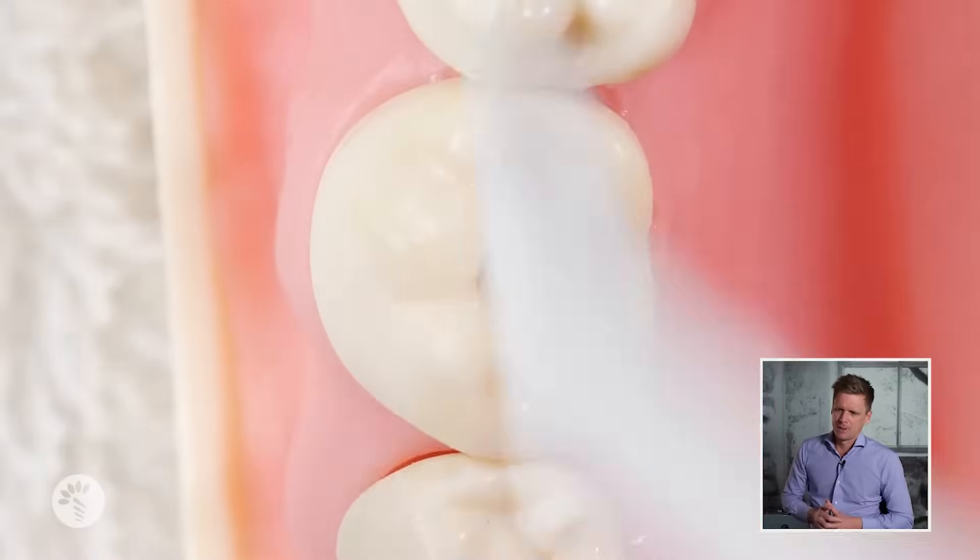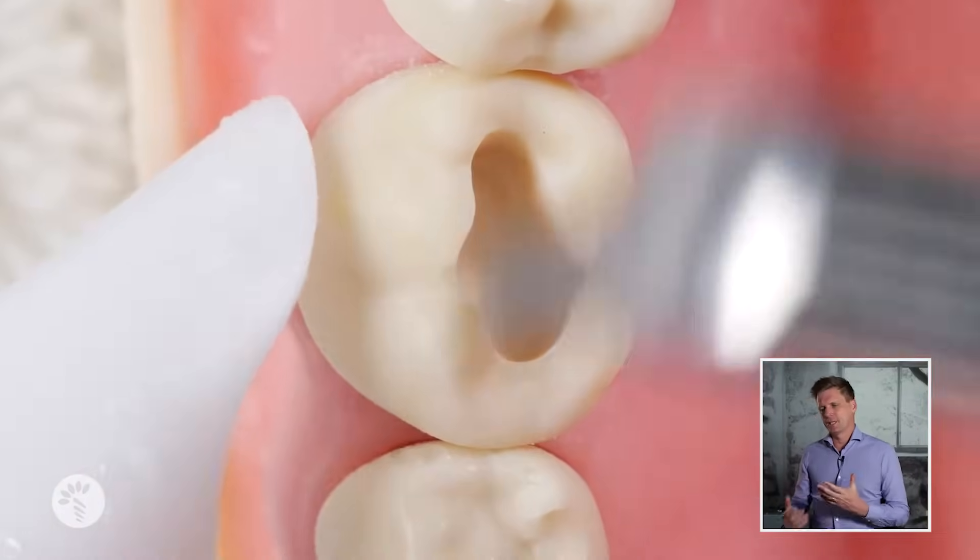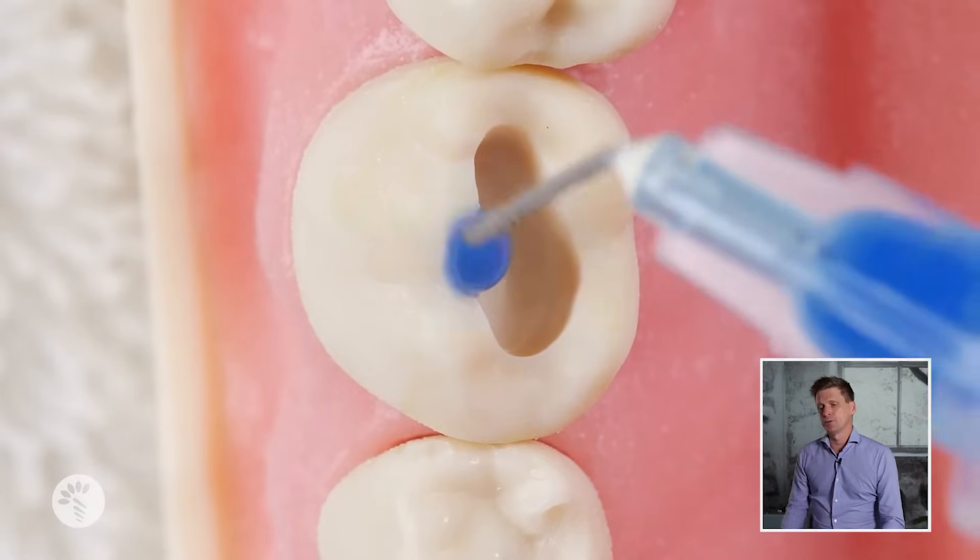The Class 1 composite is often seen as a simple thing but it's actually quite technical. In general you want to air abrade, because one of the biggest causes of staining around composite resin is plaque or debris, particularly in the fissures on the occlusal surface — and you can't remove this with etch. Using an air abrasion device to go around and clean off all of the margins is really useful, and it makes the procedure fast. Mostly it gives you a much greater chance of having no staining.